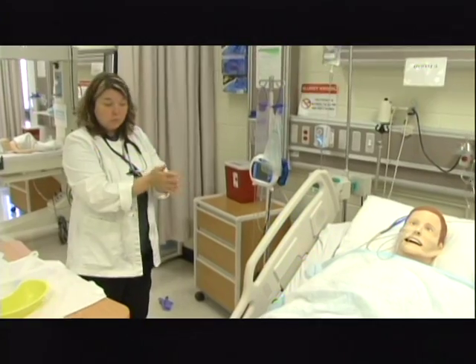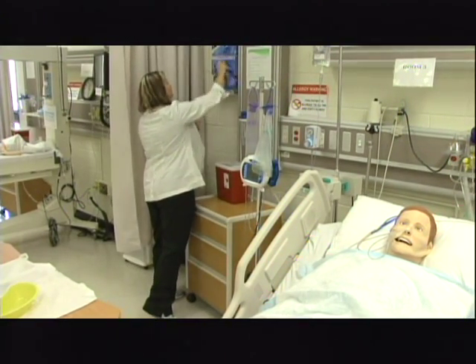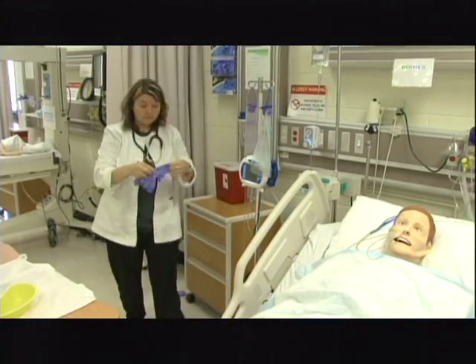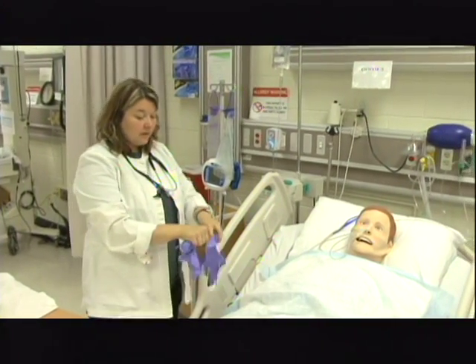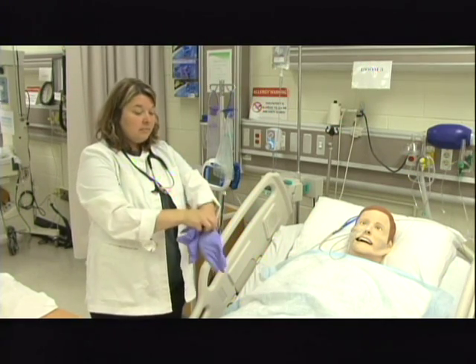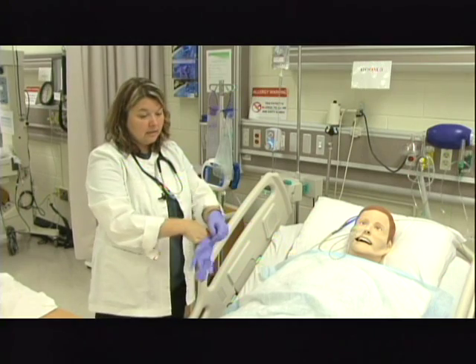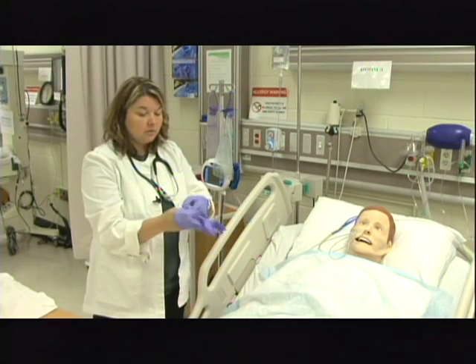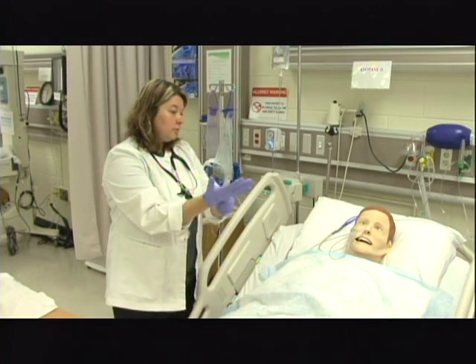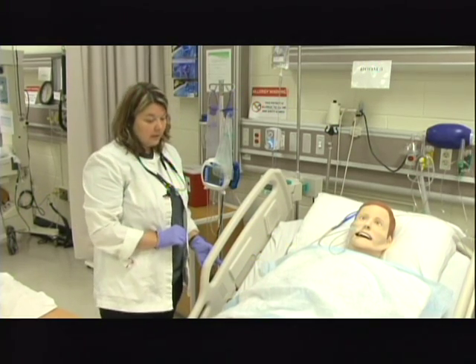Once I get all foamed, I'm going to get a new pair of gloves. And I'm probably going to raise his bed to a working height for me. Remember, he must stay at least semi-Fowler's position here because he has an NG tube in and he is predisposed for aspiration because of that. I could roll him up to a higher level if needed. For now, I'm going to get the bed to my working height, as I said.